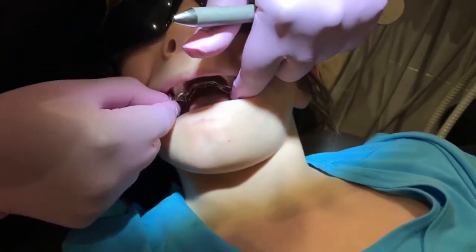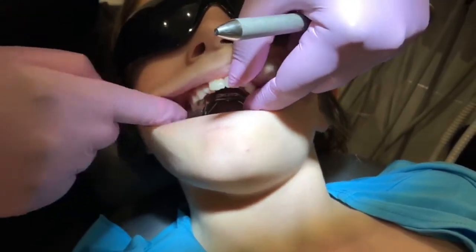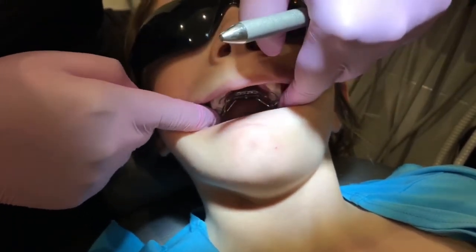And so we're going to just place it. And literally it's fitting beautifully. I don't even have to get her to bite down on it and I can see that the fit is quite good.